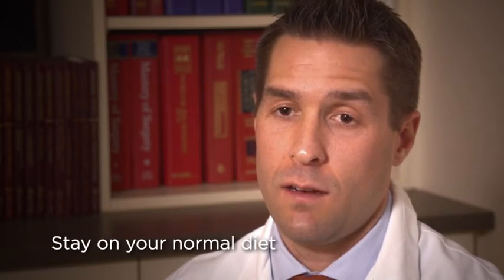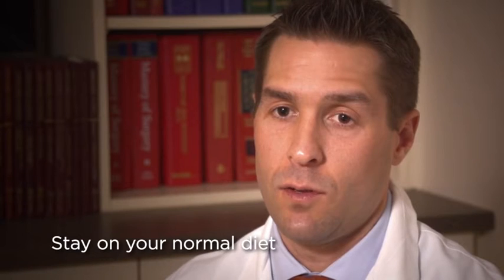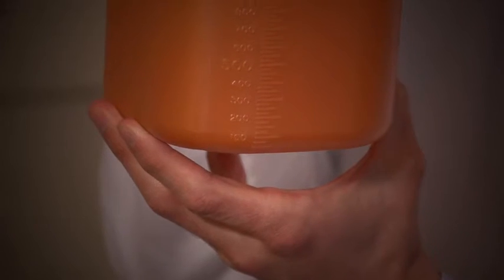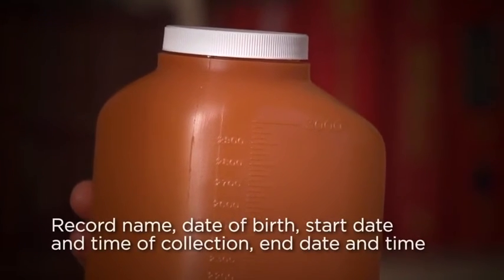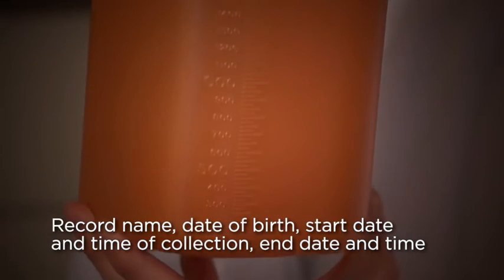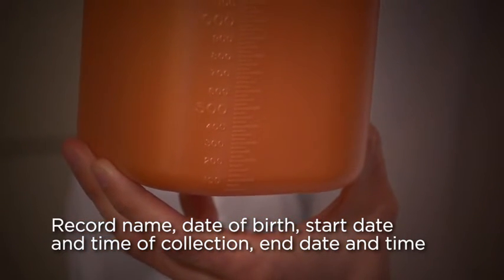During the time of the collection, we would like you to keep your normal diet, fluid intake, and activity level. Please do not alter your diet unless you're specifically instructed to do so by your doctor. We really want to understand what is going on in your urinary environment under real-life conditions. This is the container that you will be given for the urine collection. It is very important that you write on the bottle with permanent marker your name, date of birth, date and start time of the collection, as well as the date and end time of the collection.